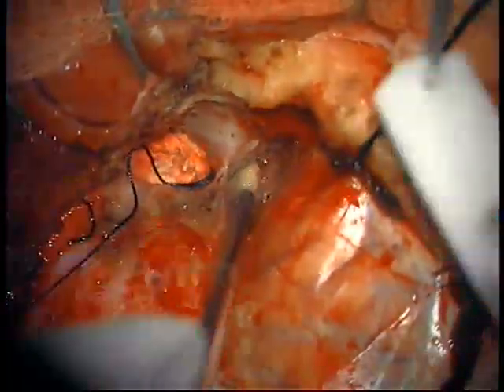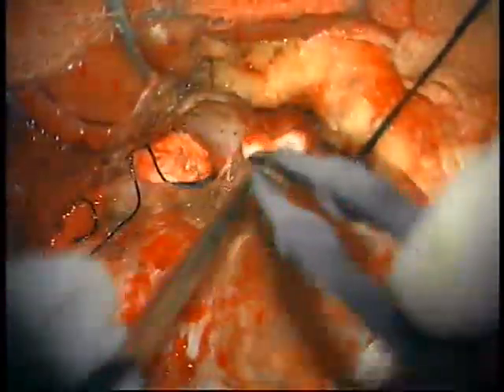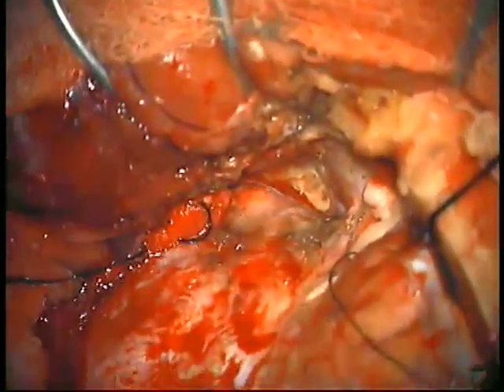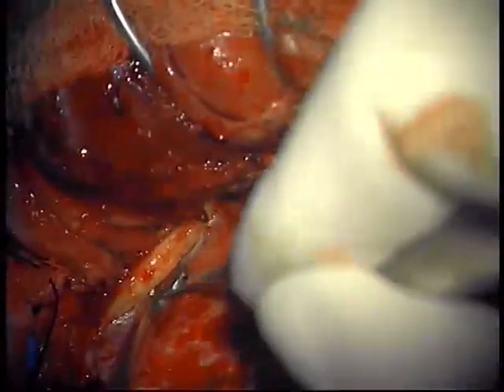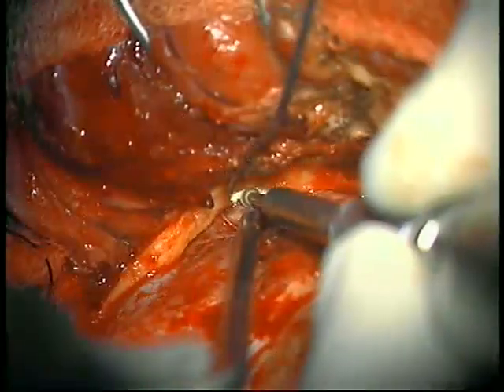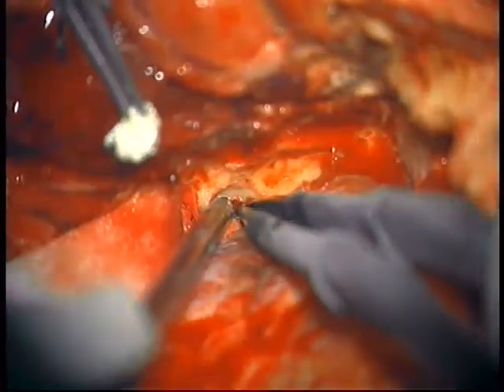Now, we are ready to move into the middle fossa. At the beginning, we move the microscope laterally to start separating the dura from the bone until we get the foramen spinosum. The foramen spinosum is expanded in order to get space to coagulate the middle meningeal artery.